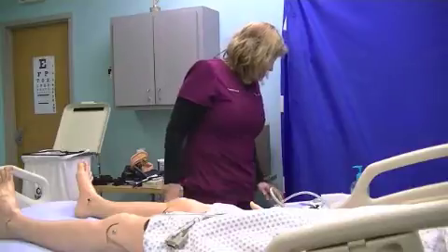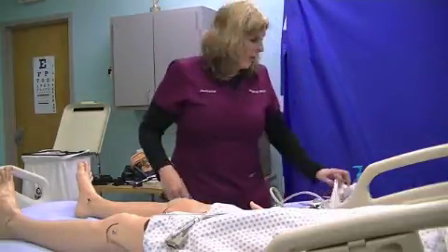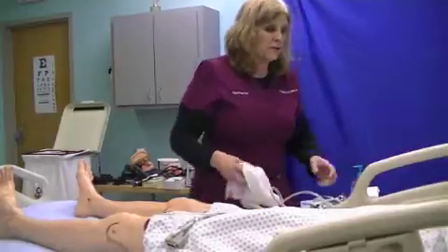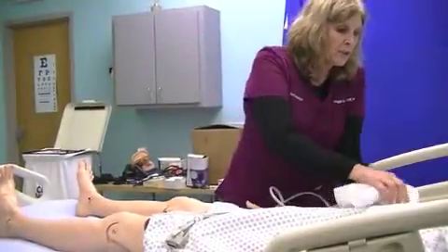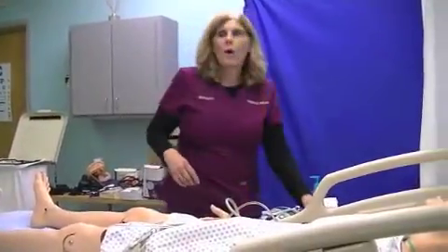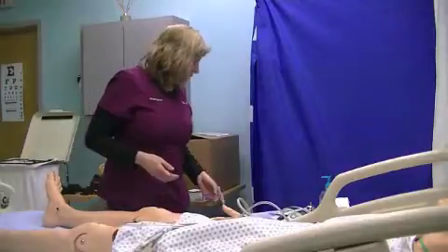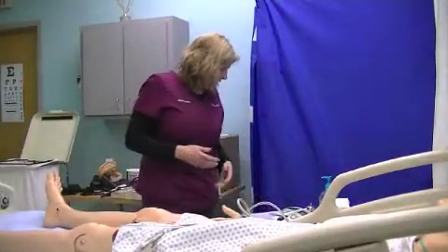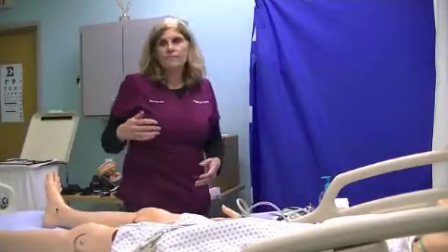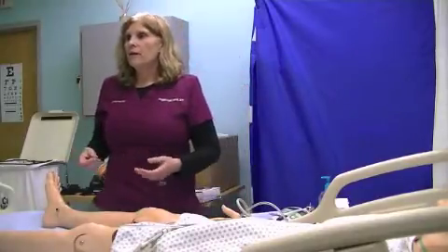For axillary temperatures, I want to make sure that I don't take the temperature after causing friction. I want to make sure their underarm is dry, but I don't rub and cause friction, because friction will elevate the temperature. And if they have a fever, or if they have hypothermia, this is not the best method, because it won't be an accurate reading for them.